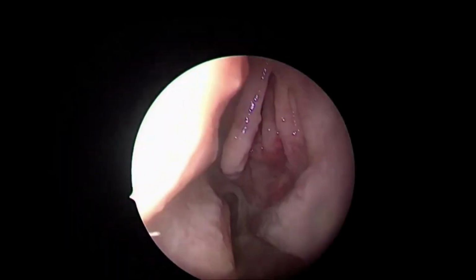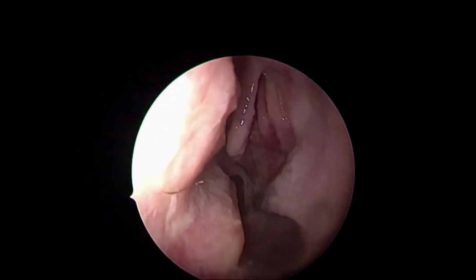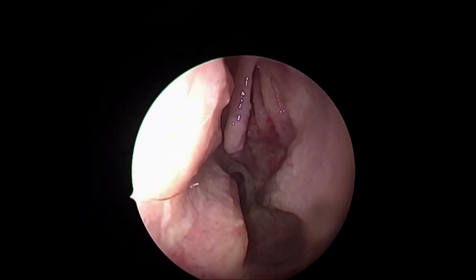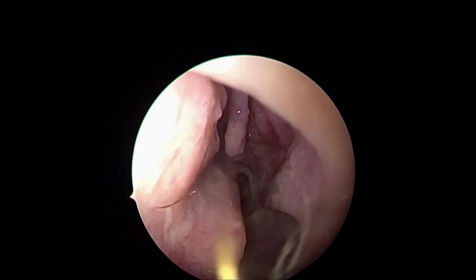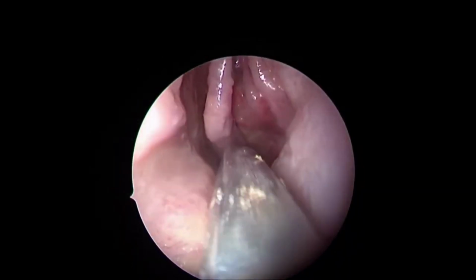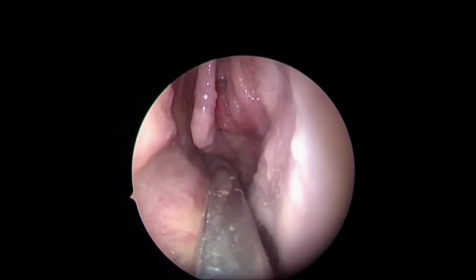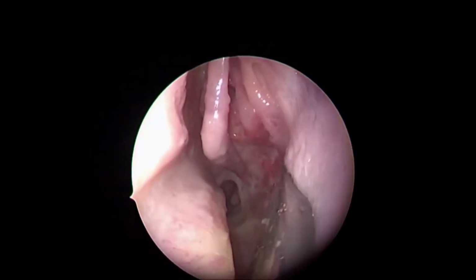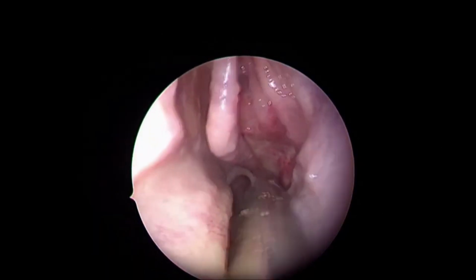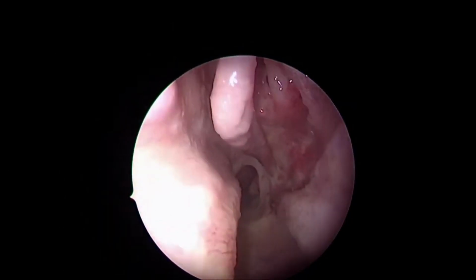Yeah, please. The only thing is, in a live surgery, that inferior turbinate, sometimes we tend to outfracture it to get access posteriorly. So that helps in a cramped and narrow space. Yes, that's a very important point. What he's trying to say is that sometimes the bony projection is over-projecting, and by means of the back end of your curette, you can outfracture it to enlarge the working space and the area overall.